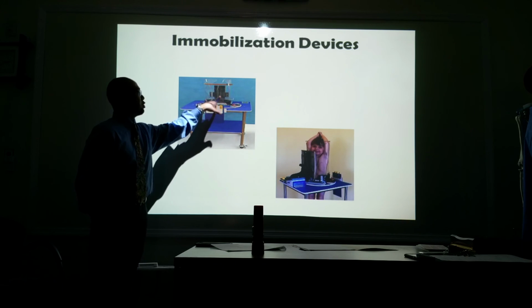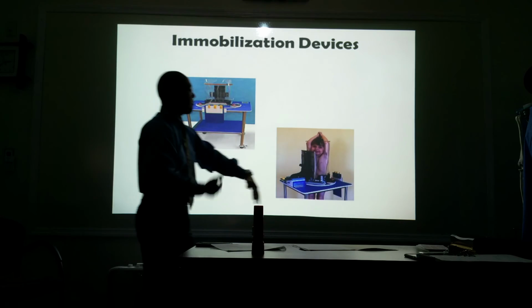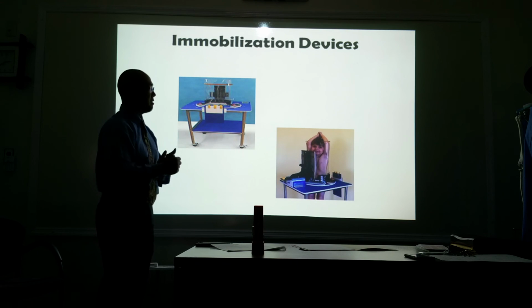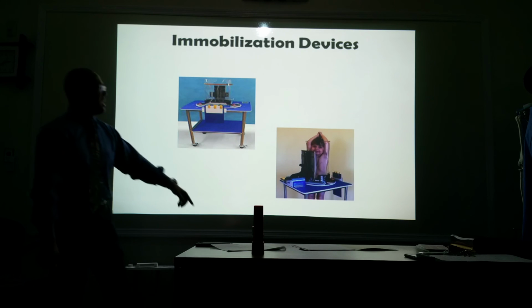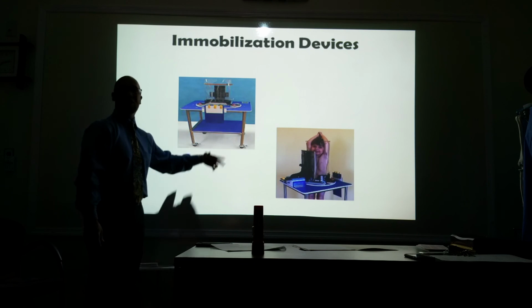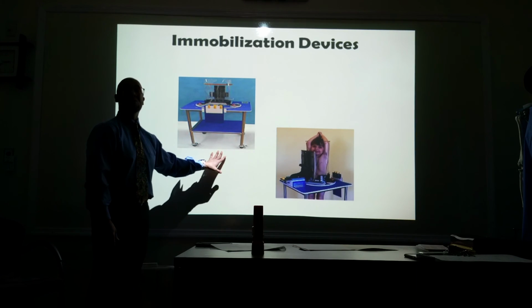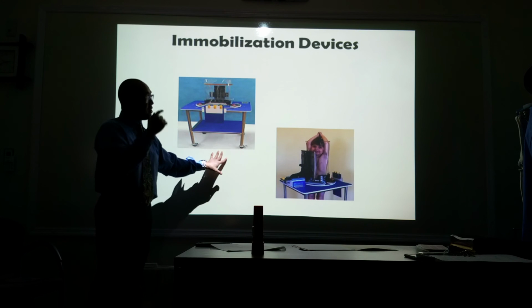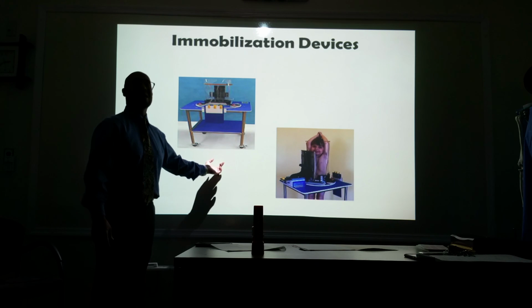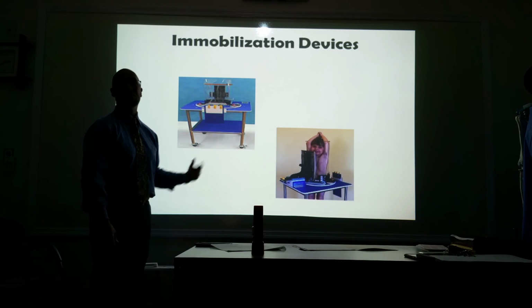You got your plexiglass, which is radiolucent. Arms up. We restrain our patients. They're sitting on a bicycle seat, so we can rotate our child facing forward, backwards, or on their side. And we get it done right the first time. No motion. Yes, the parents are going to look at you and think you're torturing their kids, but the bottom line is it's better than having to go back and redo it and re-exposing the child. I'd rather get it done right the first time than having to go back and say, your child moved. Now they're really pissed off at you. I would rather them be pissed off at me for using that than pissed at me for re-exposing their kid.